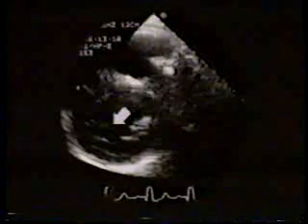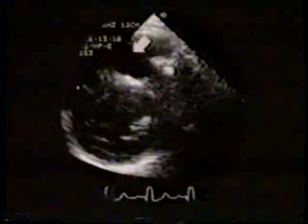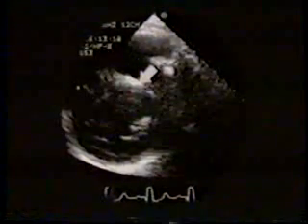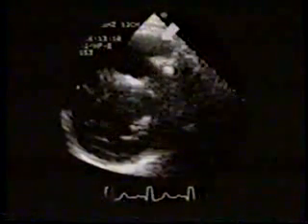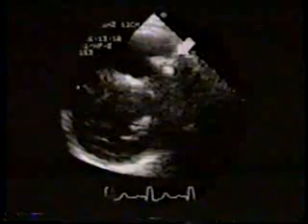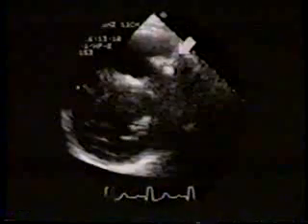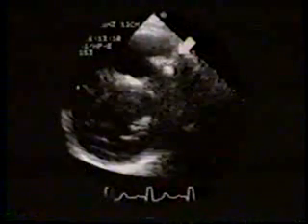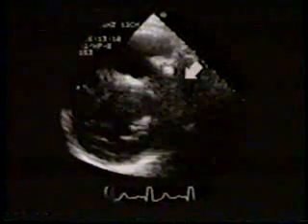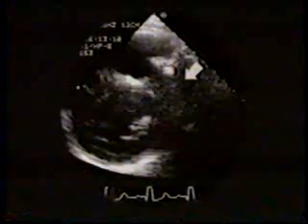This is the left ventricle, right ventricular outflow tract, and here is the intact septal patch. The origin of the conduit can be visualized in this position. This is the conduit valve, which is thickened, calcified, and immobile. The distal conduit is poorly seen in this area.